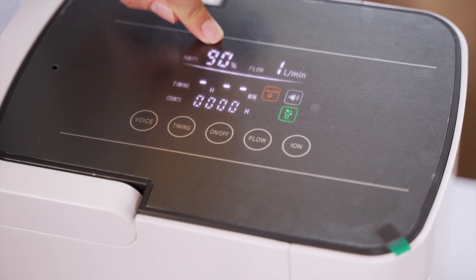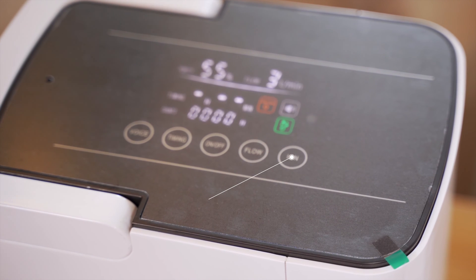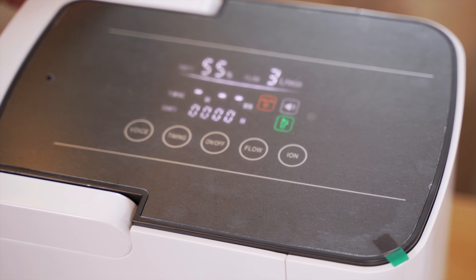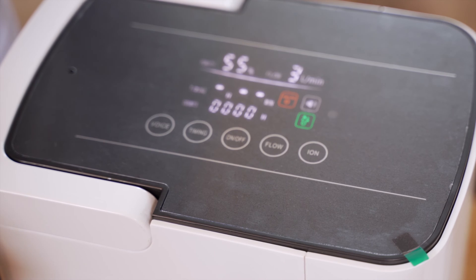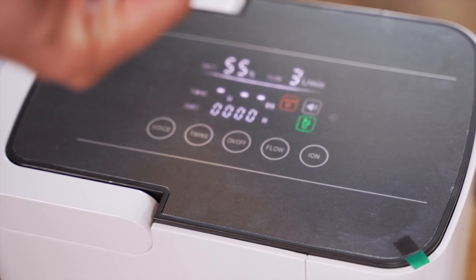You can see the oxygen purity here. We also have the anion button, which purifies the air — the anion gives negative ions to make sure the air filtered is clean. On the back, here is the filter screen and the filter cotton, which you place at the back.